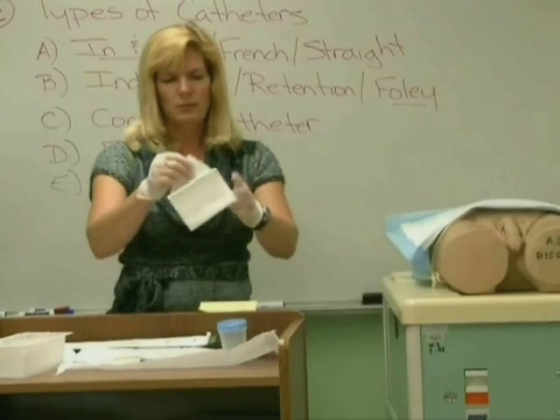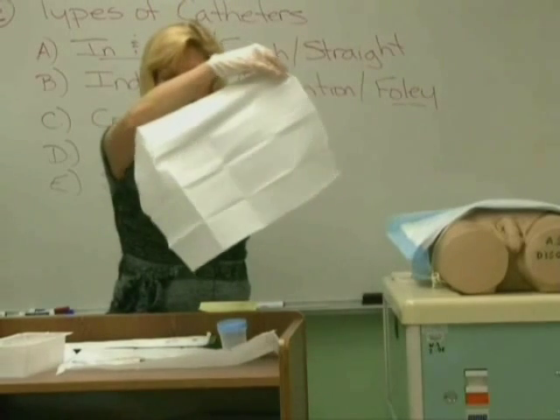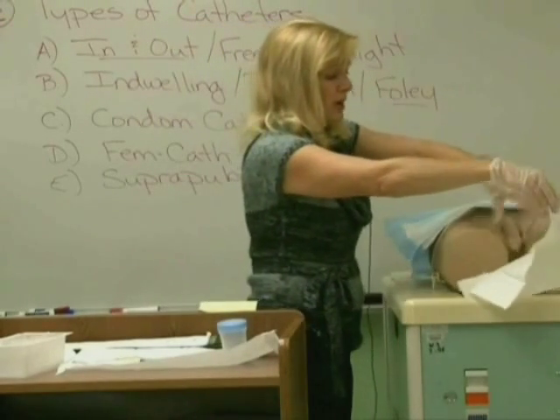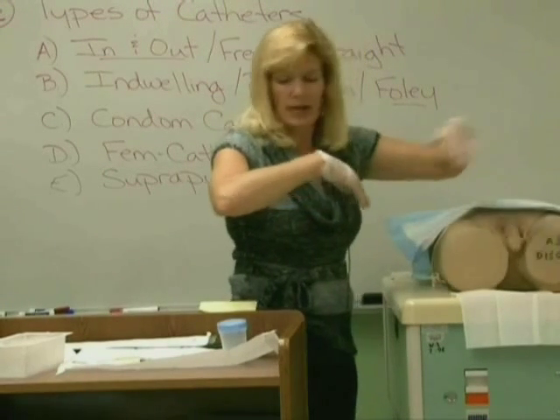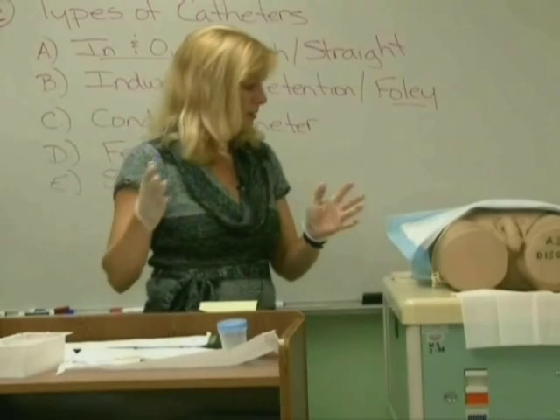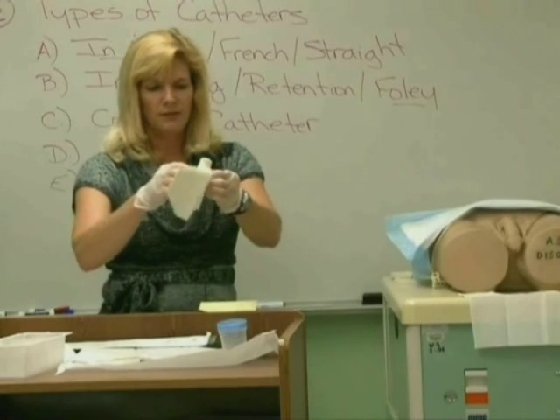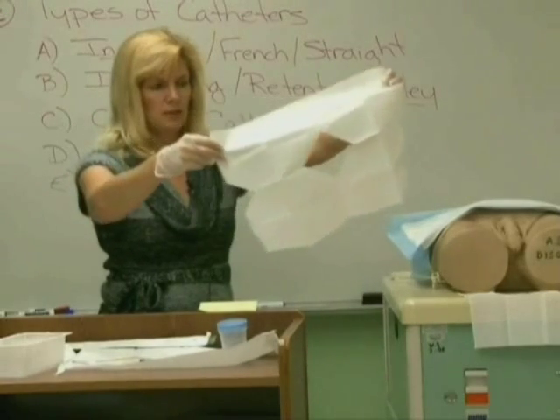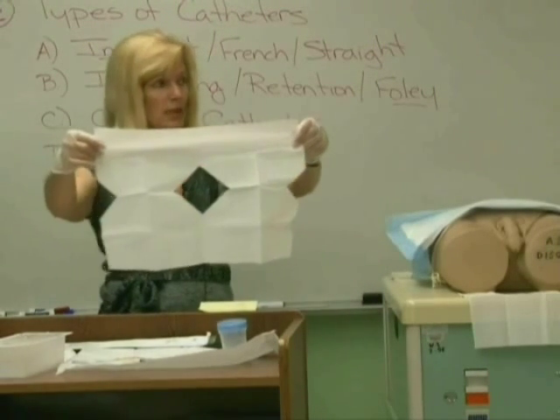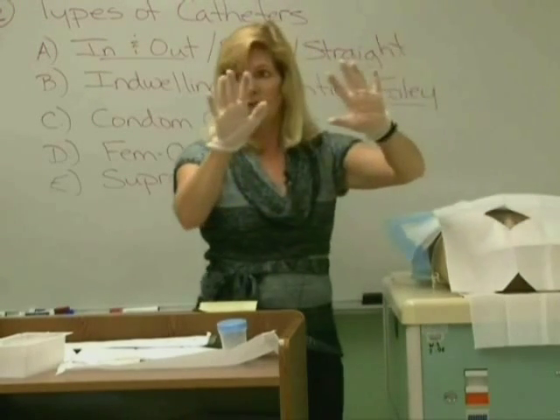Take your first drape — you could have done this right after putting on sterile gloves. The drape has a shiny surface and an absorbent surface. Put the absorbent surface up and the shiny surface on the bed, then drop it between the patient's legs. The patient's legs should be spread out. Don't touch the patient's legs with your sterile hands or you'd break sterility. If anything spills it will absorb on the absorbent side. The second drape is the fenestrated drape — it's like a bullseye, absorbent on both sides, and I use it on male patients for privacy. Discard it for female patients as it gets in the way.